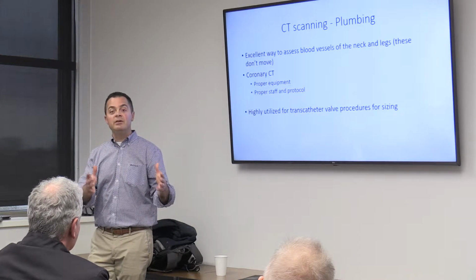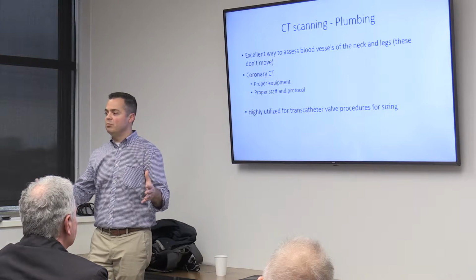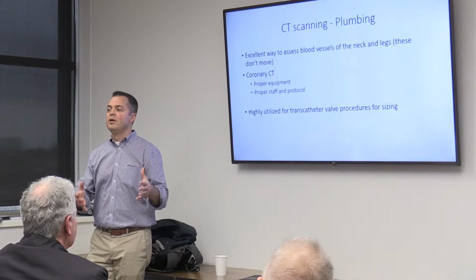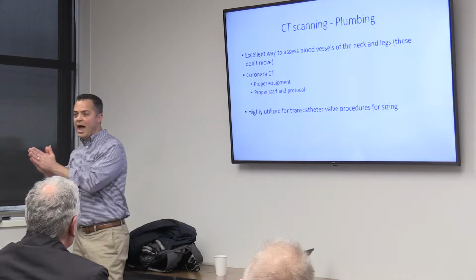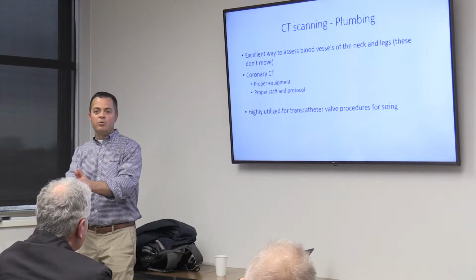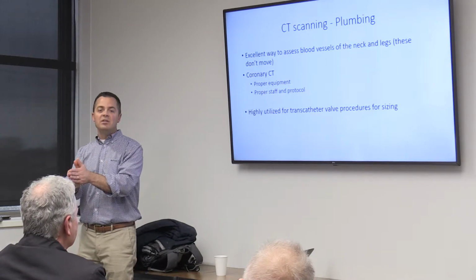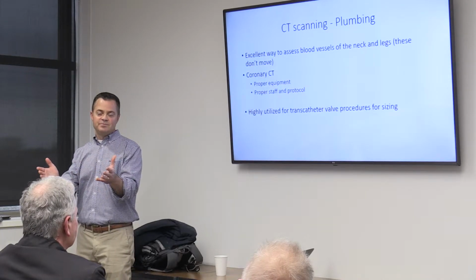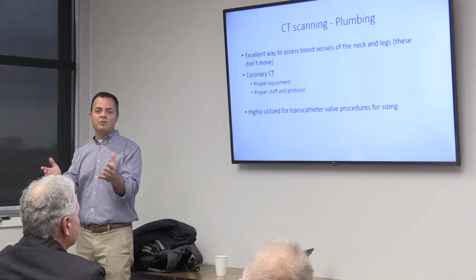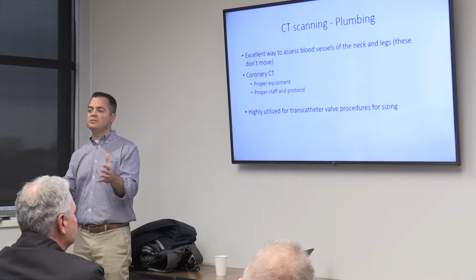And sometimes we'll even give people medicine to slow their heart rate down before the scan. So if any of you have ever had one, we'll give you some medicine to slow your heart rate down the morning of the test, so my techs can time the acquisition of the scan with when your heart is relaxed. That's what they want to do. So think about that. We're talking about milliseconds here, right? 60 beats per minute, 50 beats per minute, okay? We need to acquire a CT scan quickly while your heart is relaxed. That's when you get the best images.